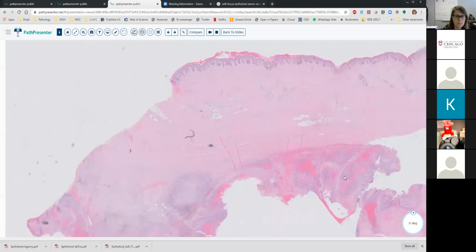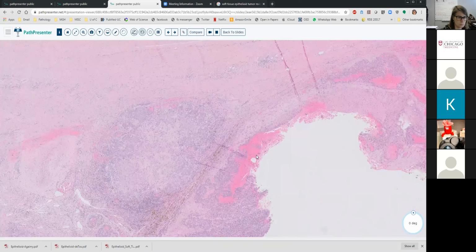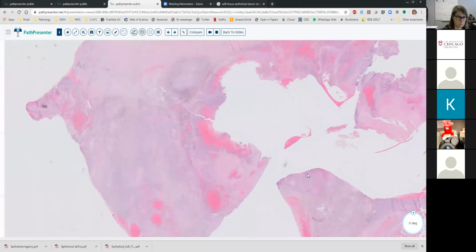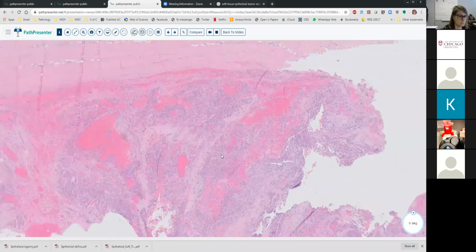Okay. So there's hemorrhage on low power. Three things I can appreciate: it's deep in the tissue, there's fibrous tissue on top of it, and then there are lobular kind of growth, but a lot of hemorrhage and pigmentation.